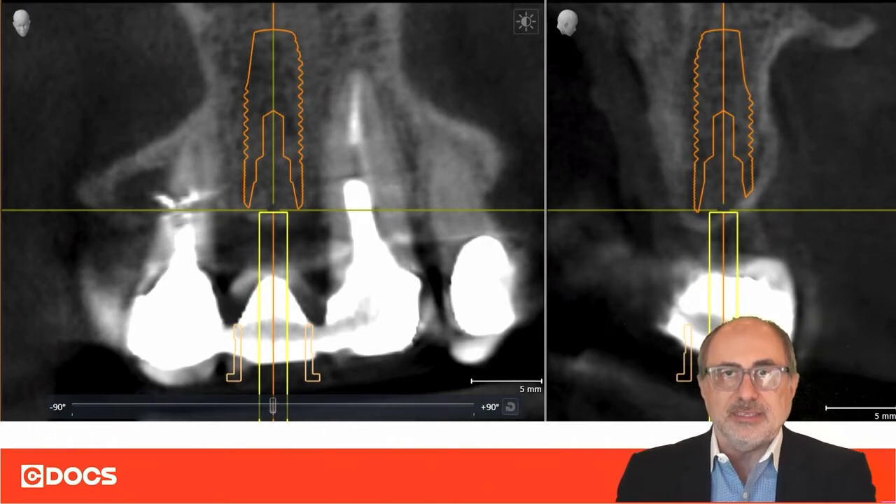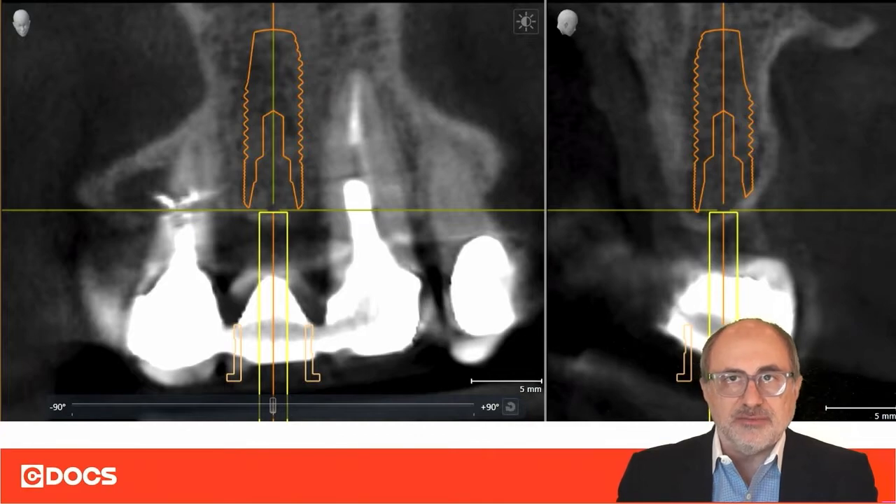By placing a profile implant — which is the only implant system on the market that has a sloped design — this Astra EV profile implant perfectly fits within this ridge, making it an ideal implant for this specific case.